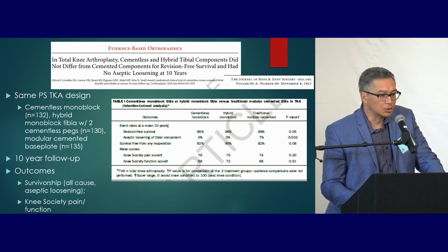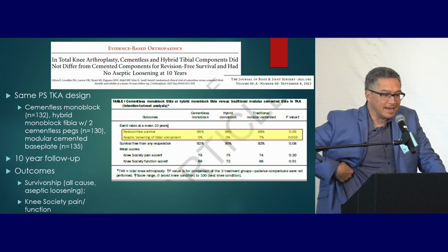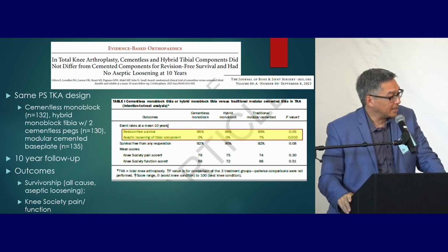So this is the next article, very similar in terms of single institution, a long-term follow-up now of a 3-armed randomized controlled trial. Same total knee design, but different fixation strategies. And they, again, looked at similar outcomes. Their results were a little bit interesting in that the survivorship was actually better for the cementless version rather than the cemented. And there's some editorial that it has to do with the implant specifically that they were looking at.